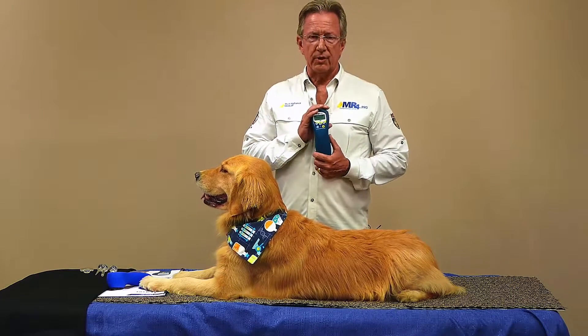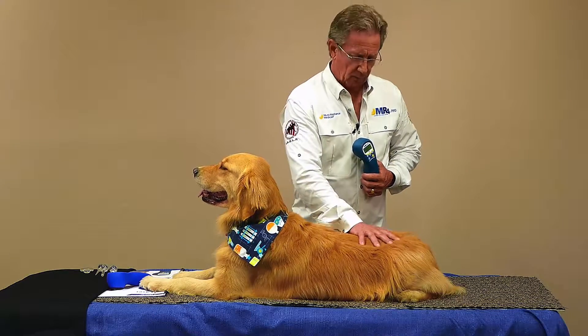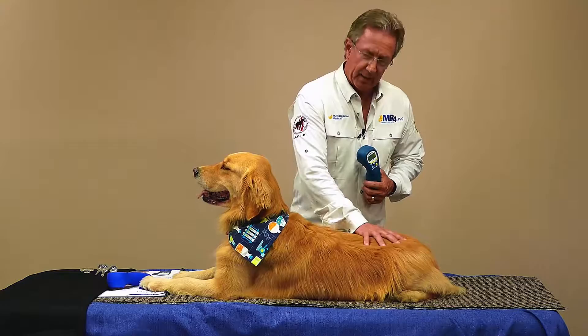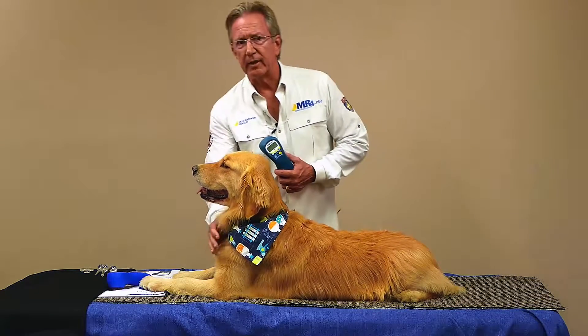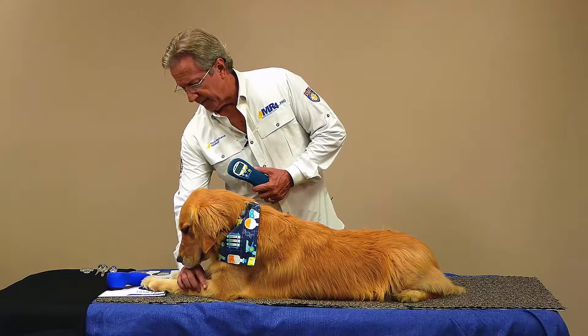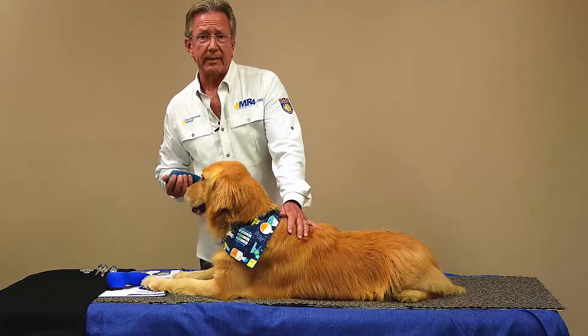Next, let's talk about how to treat wounds with your Activette Pro. We've provided analgesic relief with the unwind protocol, giving nice analgesic relief to make them feel comfortable. So we can go to a condition like a lick granuloma — visualize that we have this open wound from a lick granuloma — and now what we want to do is stimulate the healing there.